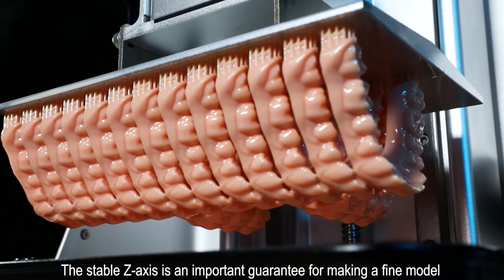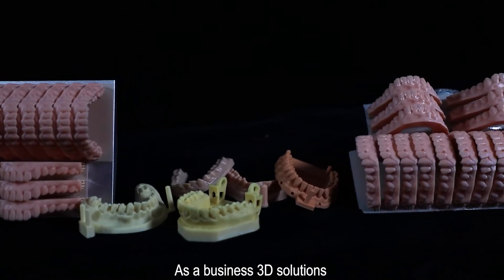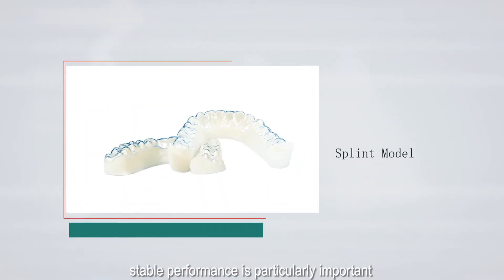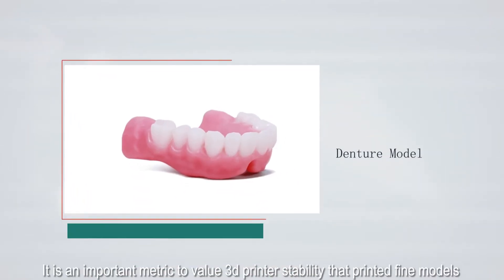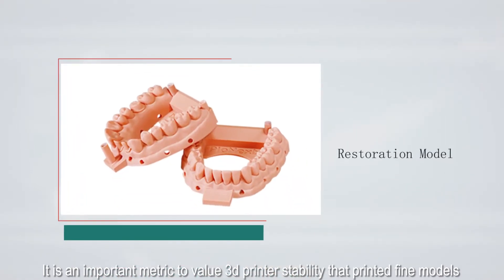A stable Z-axis is an important guarantee for making a high-quality model. As a business 3D solution, stable performance is particularly important. It is a key metric for evaluating 3D printer stability based on the quality of printed models.